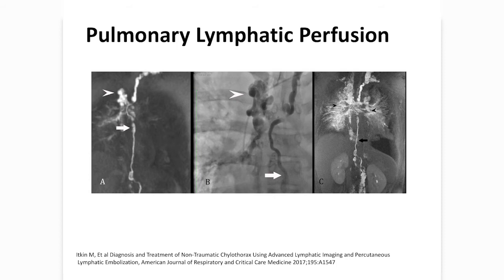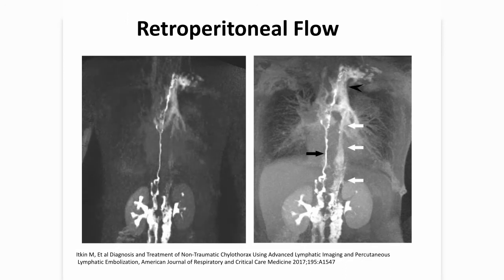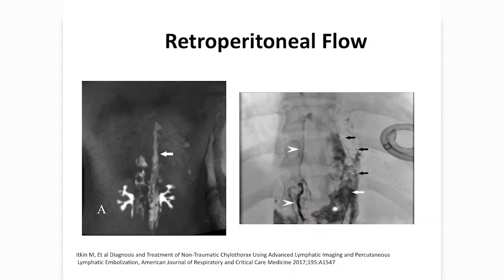Absolutely, very successfully. In these cases, we can see a similar pattern to the pulmonary lymphatic perfusion syndrome in plastic bronchitis, where this abnormal flow goes from the thoracic duct toward lung parenchyma. In some patients, we can see that there is not only flow coming from the thoracic duct, but from retroperitoneal masses. So obliteration of the thoracic duct and the masses cure the problem.